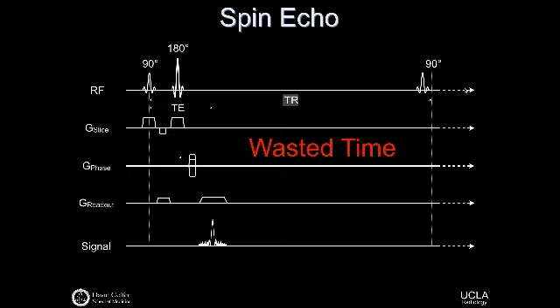So let's go back and look at the spin echo sequence here. And the hallmark of the spin echo sequence was the 90 and the 180, right? This 90-degree pulse is the excitation pulse. This 180-degree pulse is what we call a refocusing pulse, and it makes this sequence less sensitive to sources of off resonance. And so it does well when there are field imperfections, so to speak. And then the timing between the 90 and the 180 dictates when we form an echo. If I play this 180 later, I'll form my echo even later.